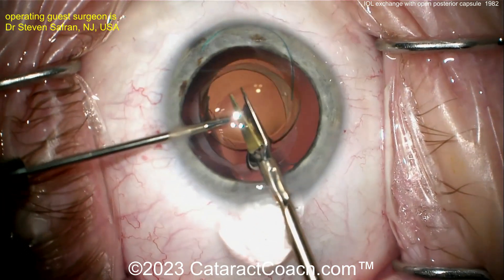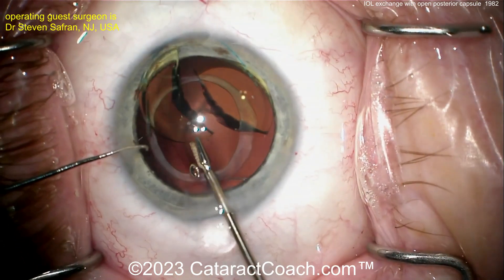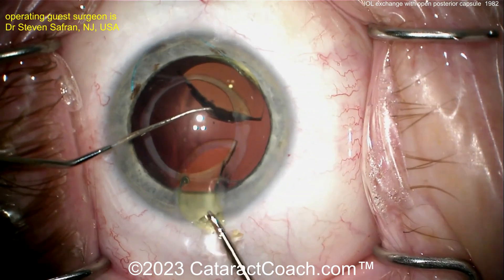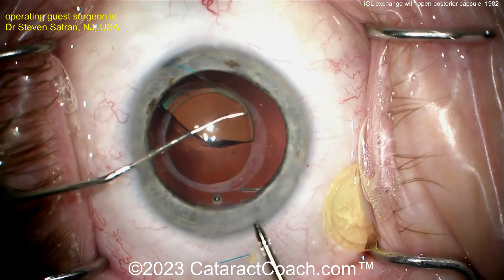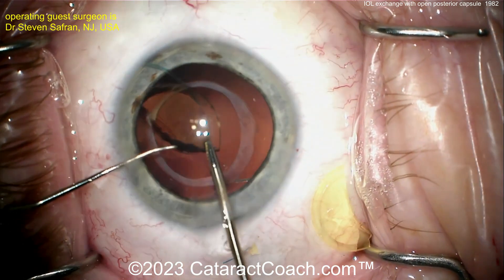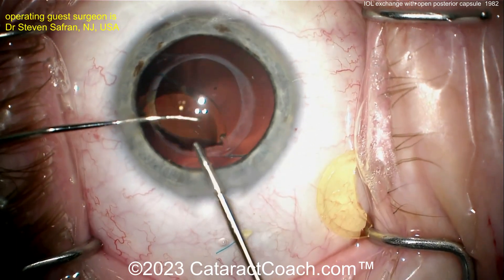More viscoelastic is added for protection. This lens is made of silicone but a different type of polymer silicone, making it a very thick lens. Microscissors are used to cut it in half. Because it's silicone it's very slippery — hard to rotate and perform a twist technique. Even as he tries to pull the lens out, notice how pieces of the lens break off.